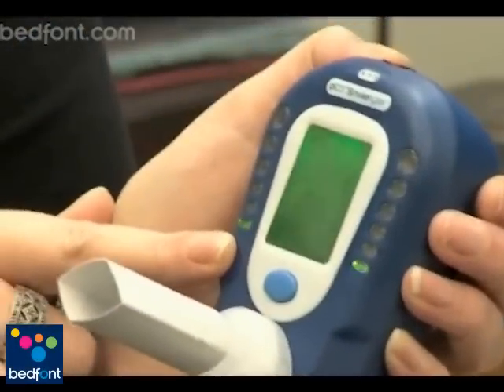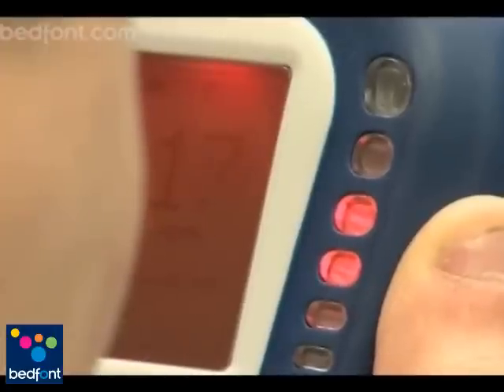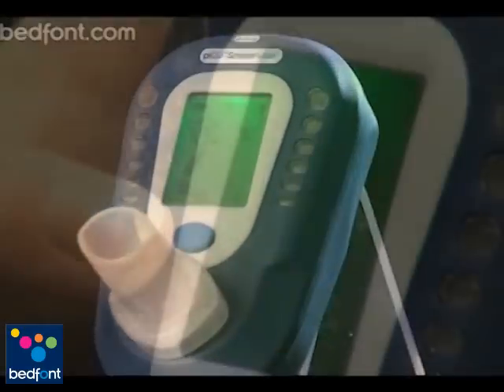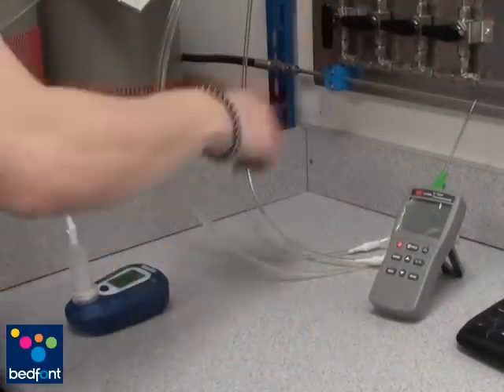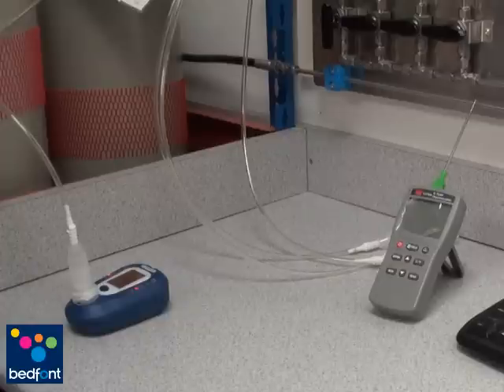Welcome to the PicoPlus calibration video. In this video we will show you how to calibrate the PicoPlus Smokealyzer correctly. The instruments are always calibrated before leaving Bedfont, however to ensure that it is ready for use and that you are familiar with the unit, it is recommended that you calibrate it upon receiving the monitor.